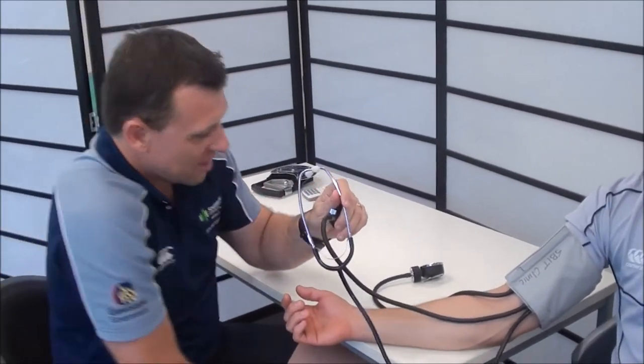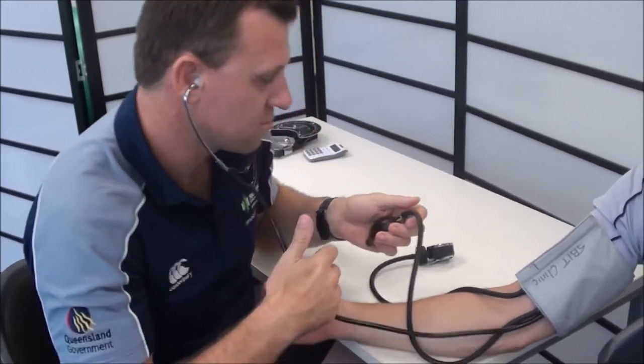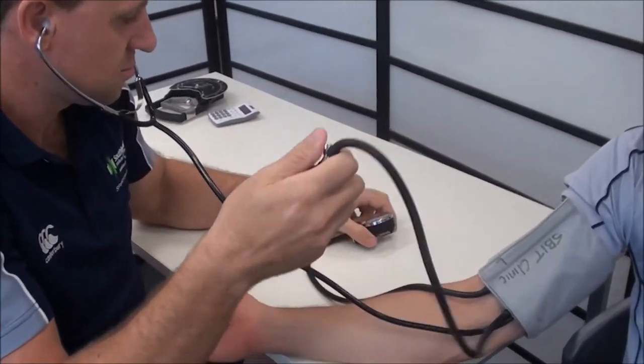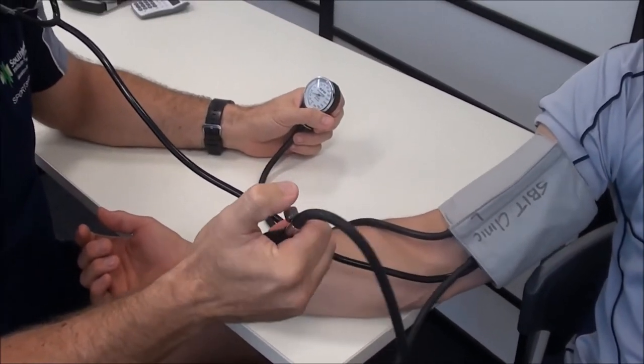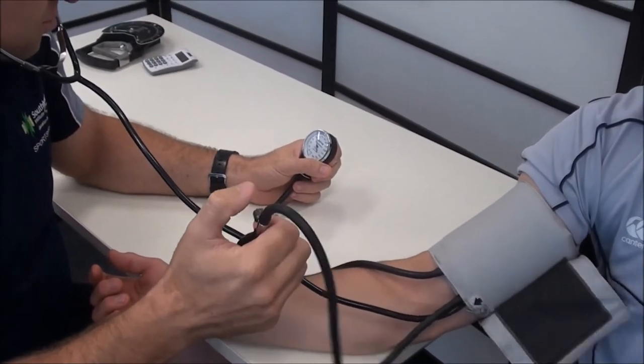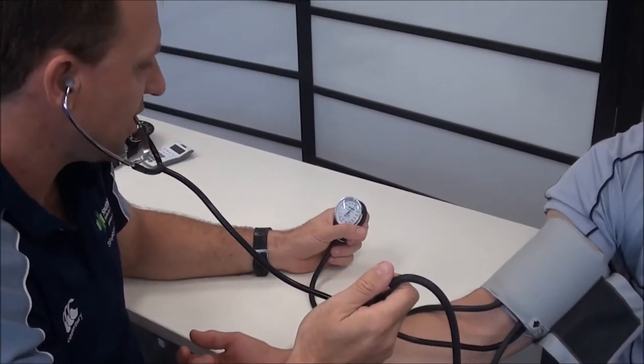We'll now inflate the cuff up to 170. Now release.